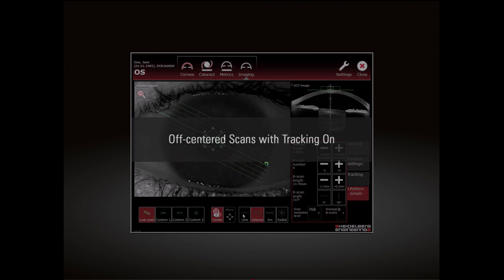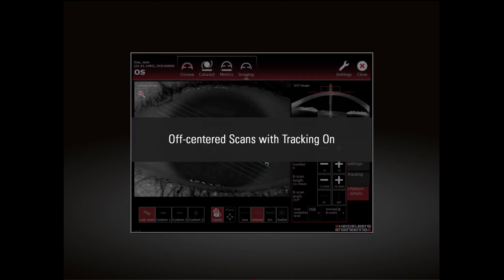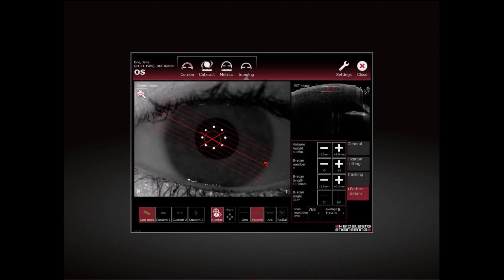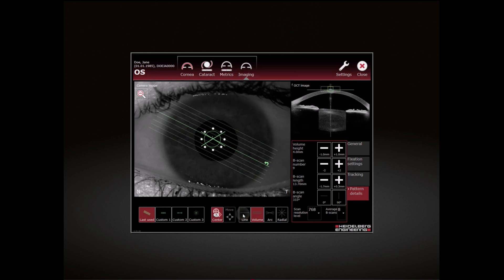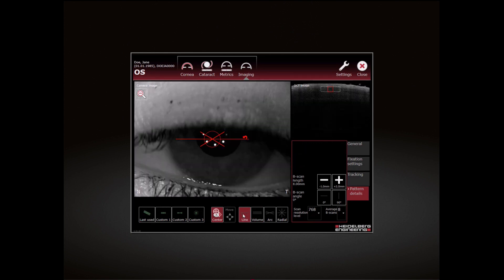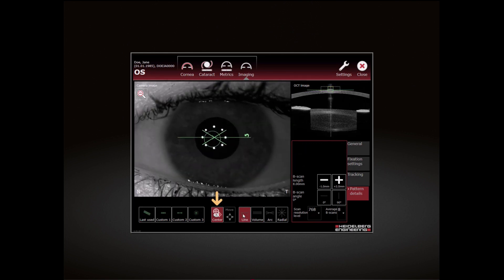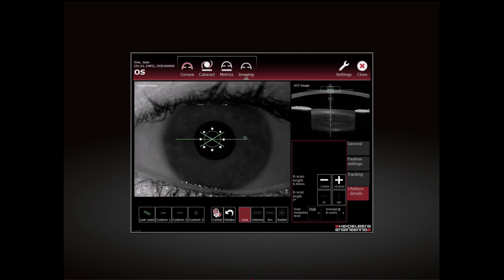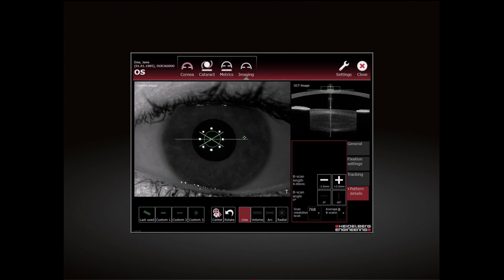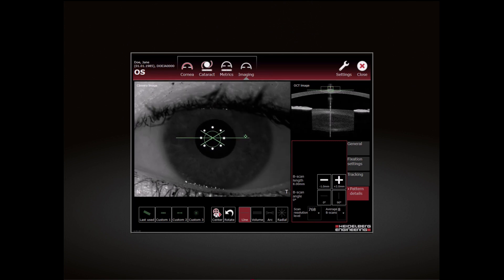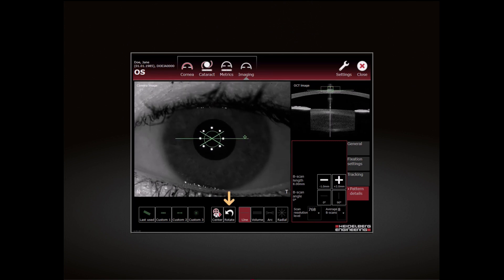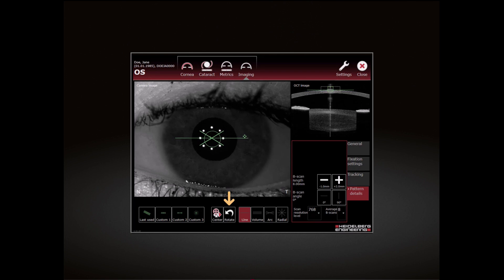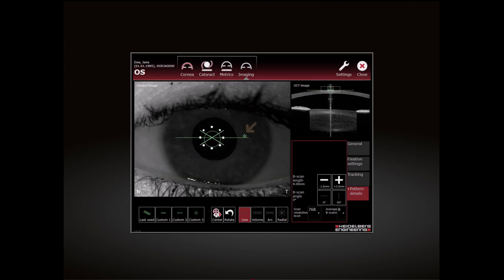Off-Centered Scans with Tracking On: To activate the off-centred scan with tracking on, tap Center. The Center button is deactivated. The Rotate button is now displayed. The symbol on the scan pattern indicates that movement is possible.